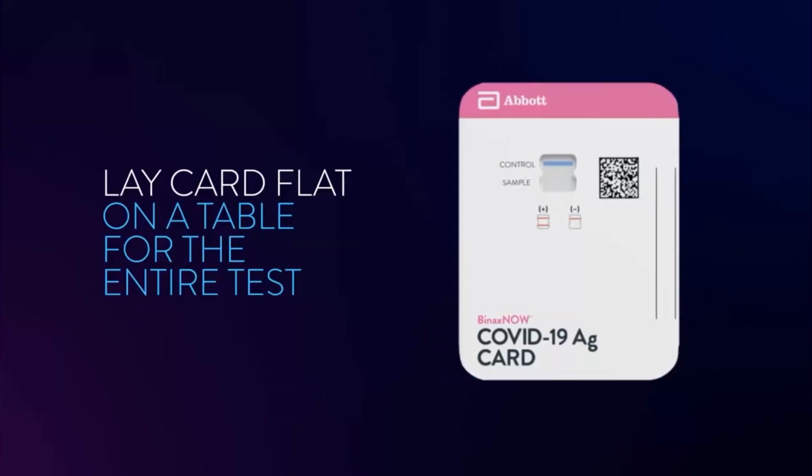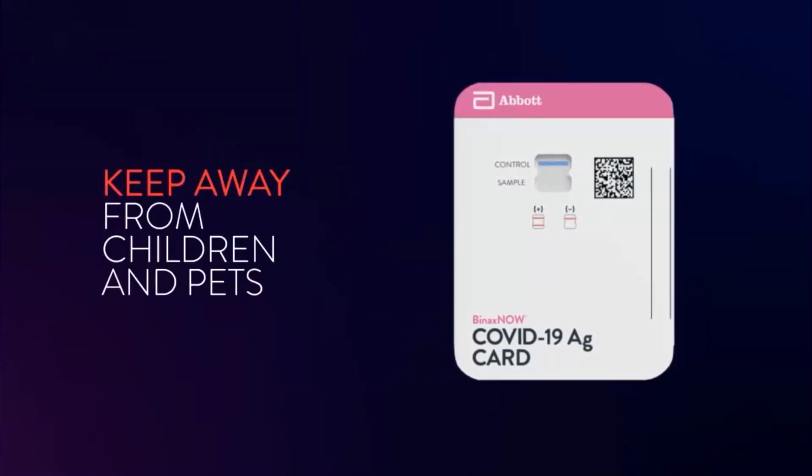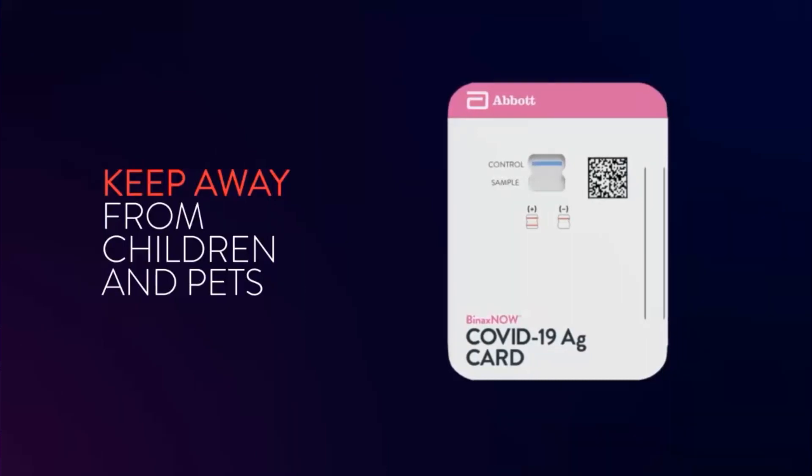The card is to remain absolutely flat on the table, so make sure you find a table where people aren't going to bother it for 15 minutes. Let's lay the card flat.